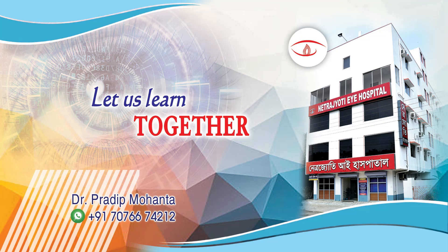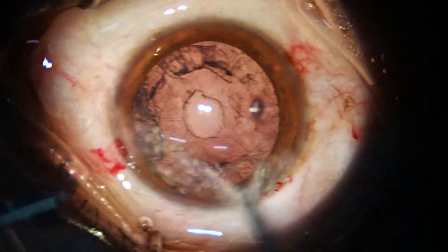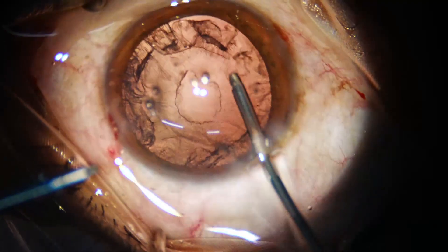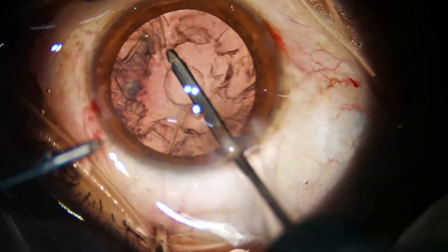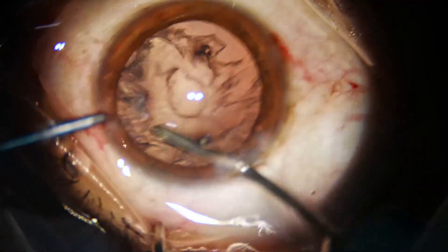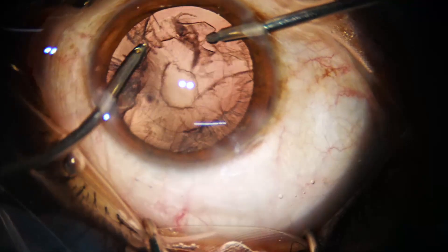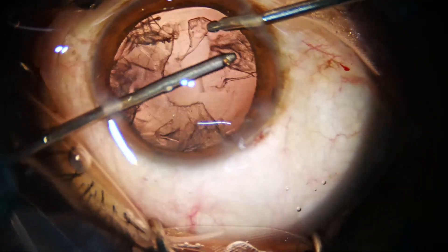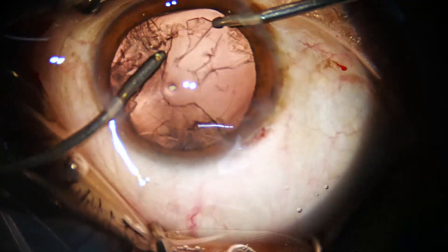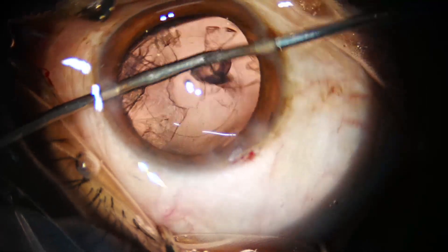Friends, through this video we will learn how to load and how to implant a multi-piece intraocular lens. First, we go with the irrigation and hydrate all around to loosen the cortex so that the cortex can be easily aspirated as we go. Now, irrigation through the right side, put aspiration to the left, and we start aspirating gradually.